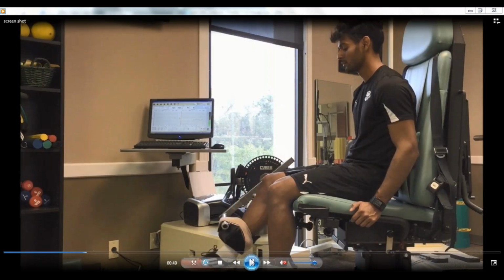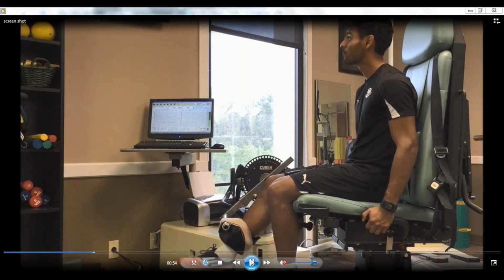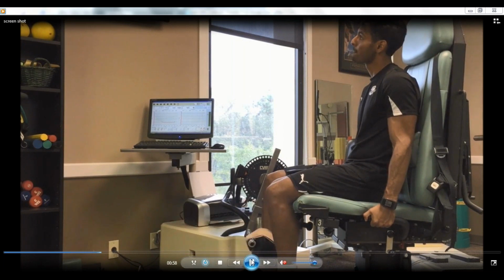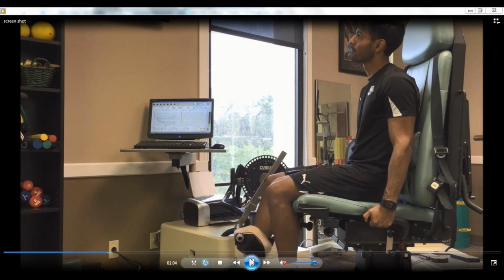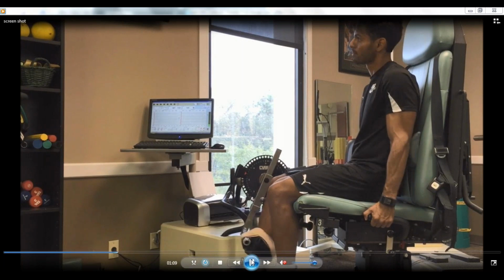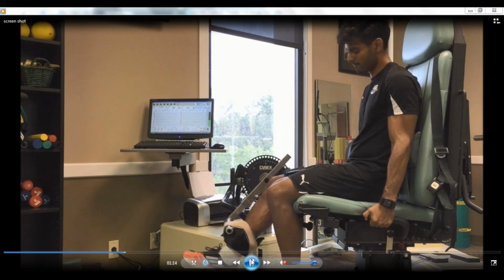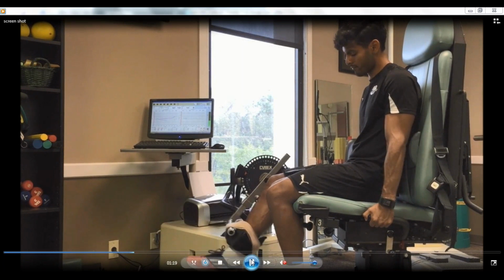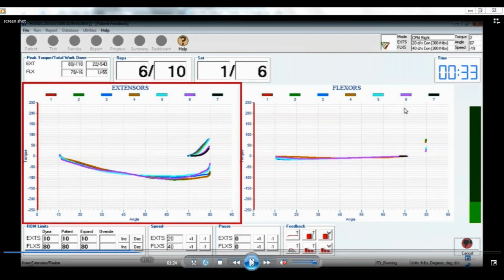So we see our same athlete that we saw earlier. He's exercising his quad here. He relaxes as the machine lifts him up, and then he contracts as it lowers him down. Since the exercising speed is faster than the resting concentric, we know that he's doing the deceleration training. I also want you to look at his quad and his knee, because you can see he's got a little bit of that eccentric inhibition occurring. A little bit is okay. If you can feel the entire room shaking because they're having so much, you need to back those speeds down for them. Now, let's pause the screen because we've got to teach you what the feedback is showing you.